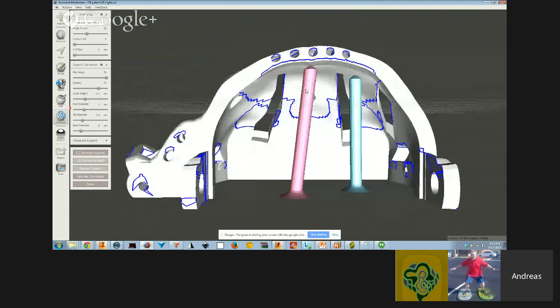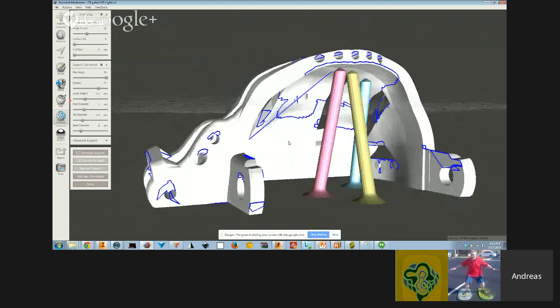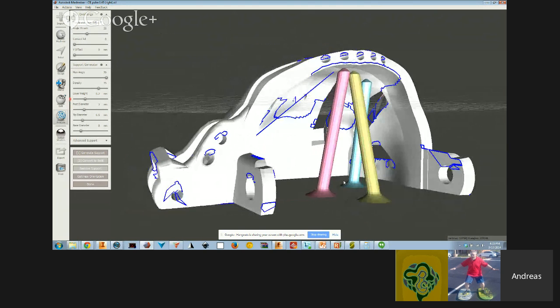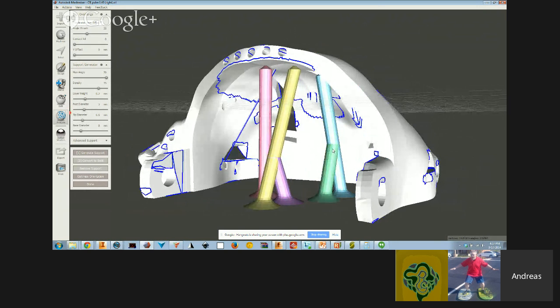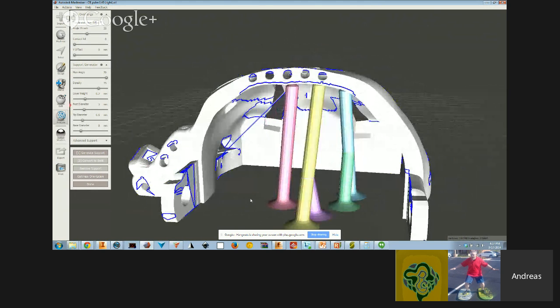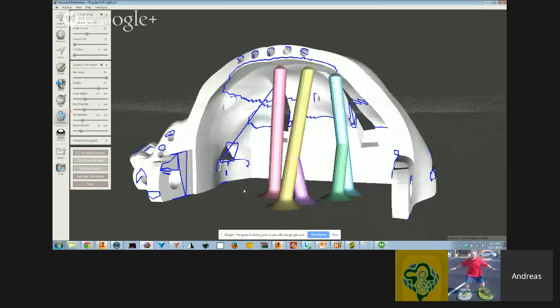Port, you can just keep clicking in an area and it'll search for supports. You saw some of that branching that I had. If you want, you can click on those branches and it'll add struts here and there. So it's good to know, in general, left clicking will add. You can click on the support and it'll add this little brace here. Clicking on the model, clicking on the support will add more of those things. You can also, like I said, drag to a specific area that you want that support to be.